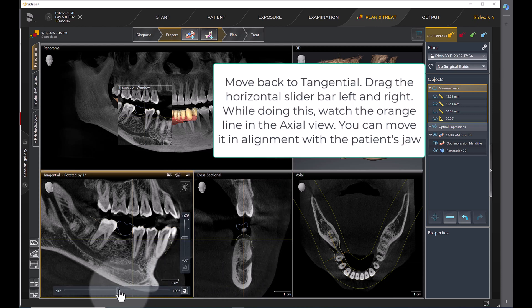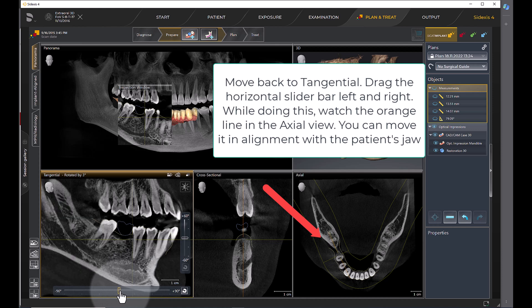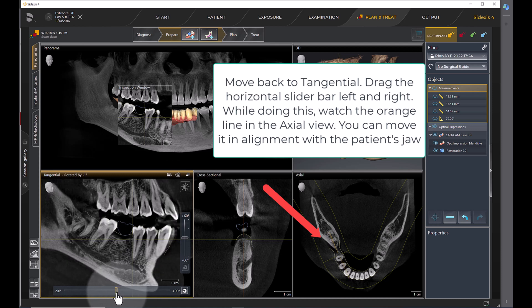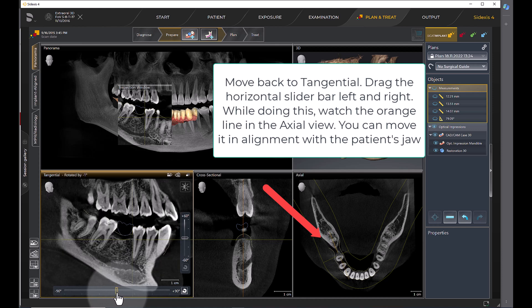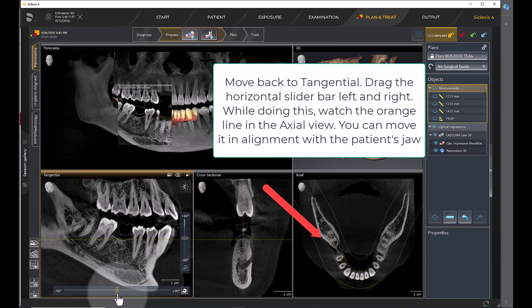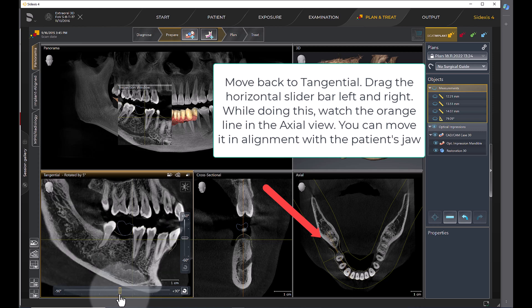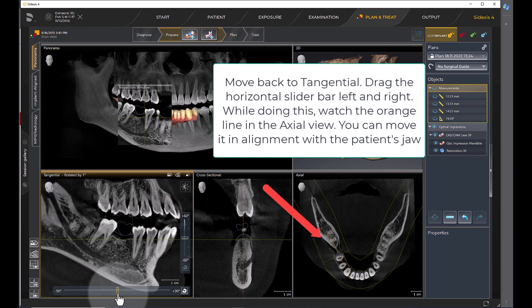Move back to the tangential. Drag the horizontal slider bar left and right. While doing this, watch the orange line in the axial view. You can move it in alignment with the patient's jaw.